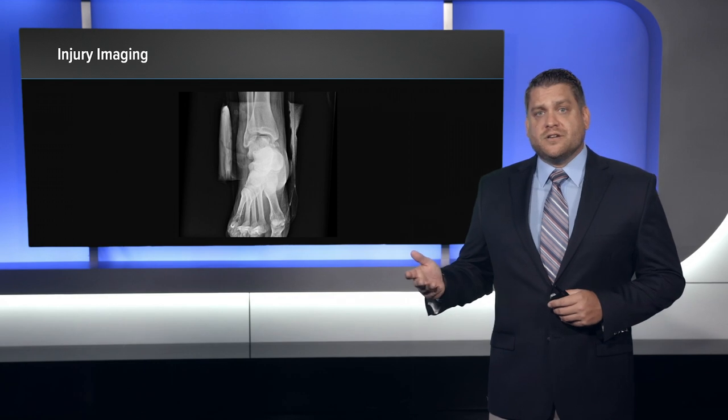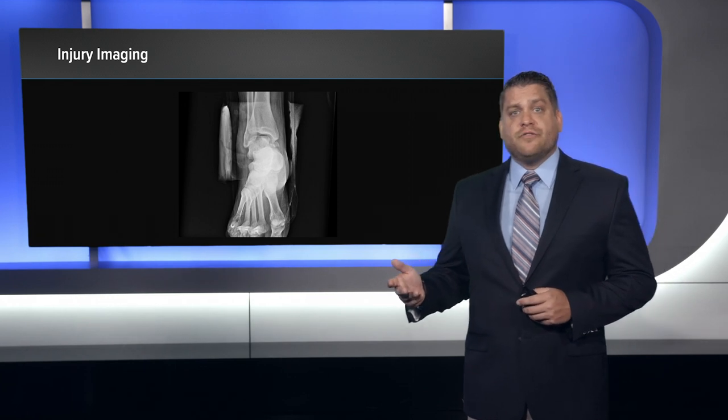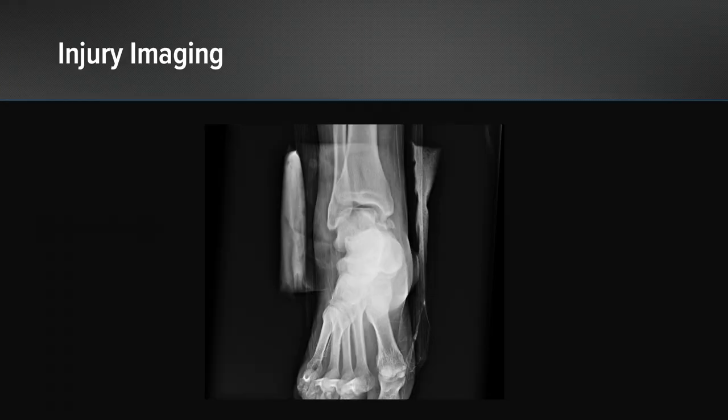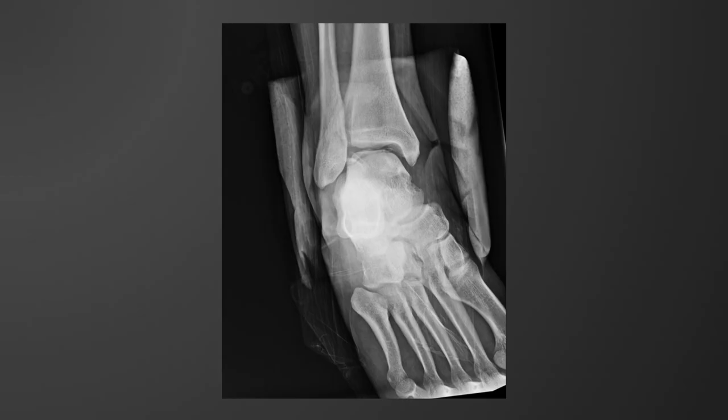These are his initial plain film images. We can see on the talus dome some evidence of a fracture. The mortise view again shows the same fracture of the talar dome.